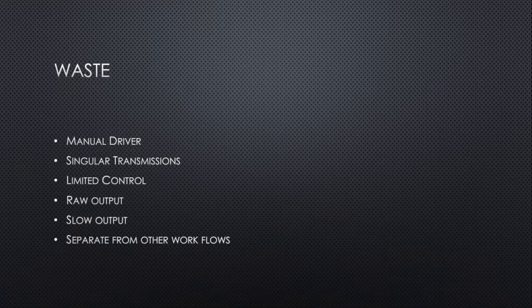So to share a little more on these wastes, this is a manual effort. We have to do single transmissions. These images are arriving one by one, and then they have to be changed manually. So there is a human input for each and every case. We have to type in the new PID number, and we can't give them pseudonyms. So we do have limited control, and any output given to us by Conquest is going to be in the raw format. They're just DCMs in a stack. There's no formatting or folder hierarchy for the output.